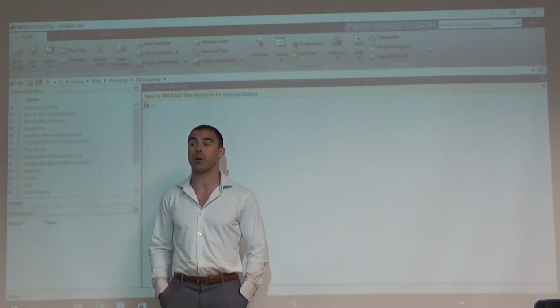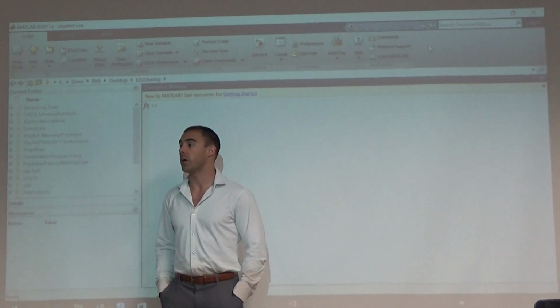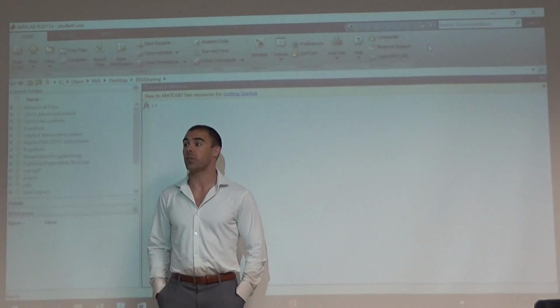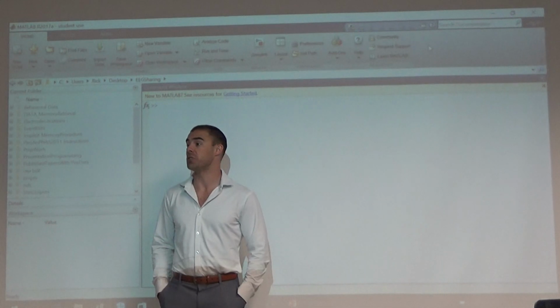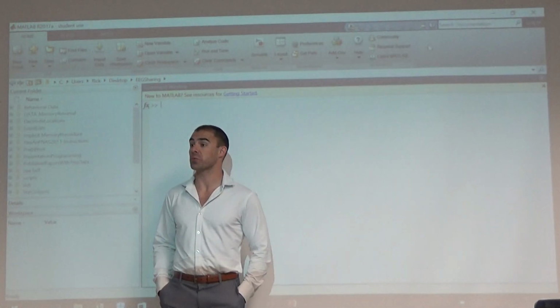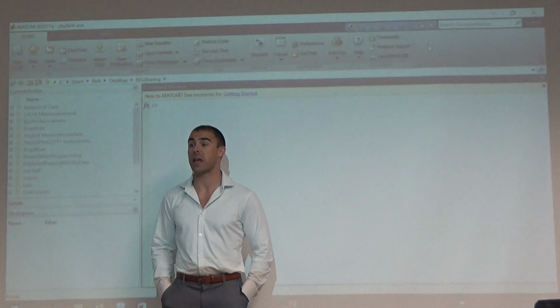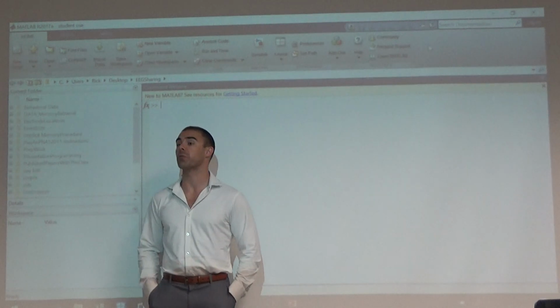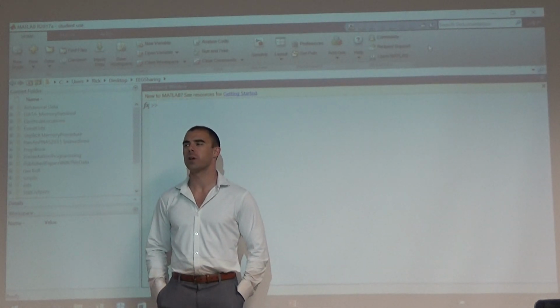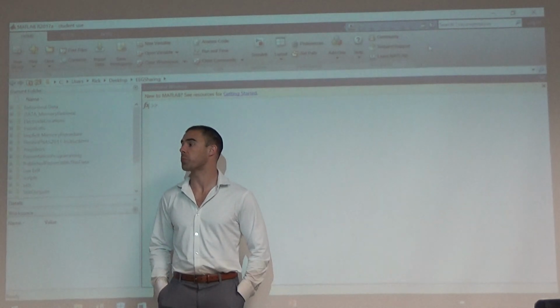So we're going to start learning what the ideas are behind it, how to work with the software, and the ideas that are important for understanding how to process EEG data, and then of course start working with the actual skills of doing it, because both of those things can be difficult at first, but with a little bit of practice they become pretty straightforward. And this is a really, really good system to do it very simply once we learn how to do it with a little bit of practice.